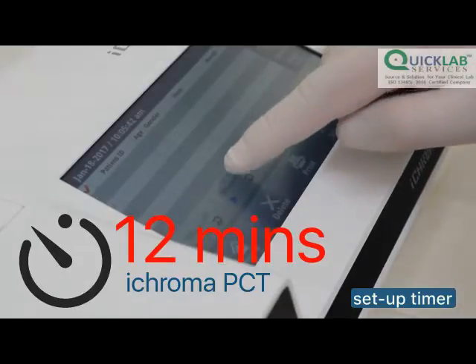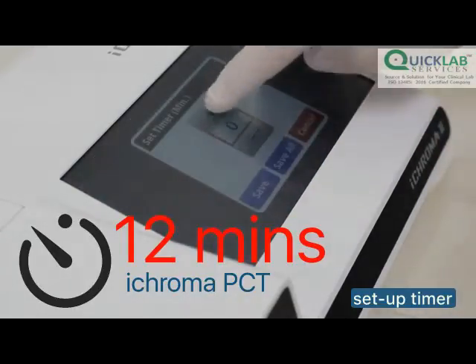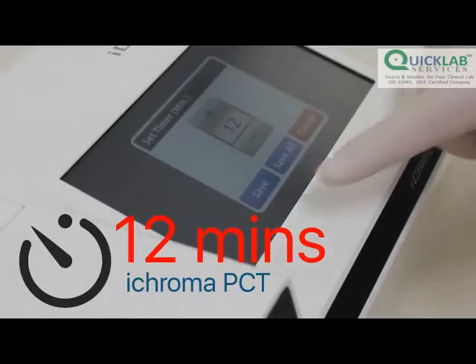Meanwhile, set the timer of ICHROMA-2 according to the reaction time of PCT, which is 12 minutes.